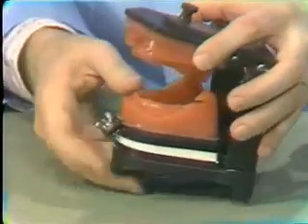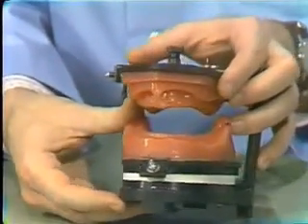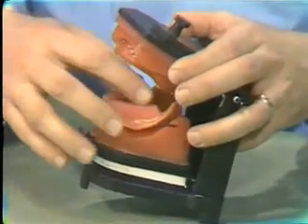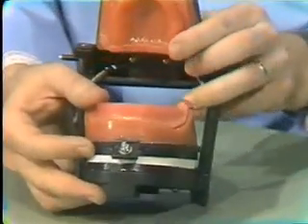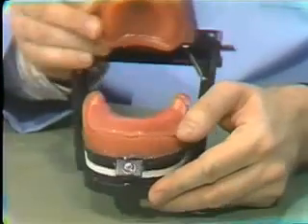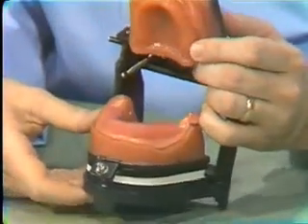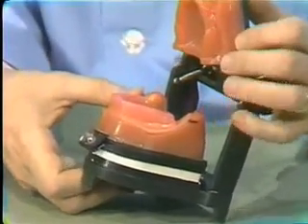The first thing that we do clinically, and the first thing we will do in this course, is to make and establish a bite rim, an occlusal wax bite rim, on the lower base plate. Now, this has already been completed up to a point when you made the base plates in the last exercise. The first thing we do when we go to the patient, and the first thing you will do here, is to refine the configuration, if need be, of the wax rim.